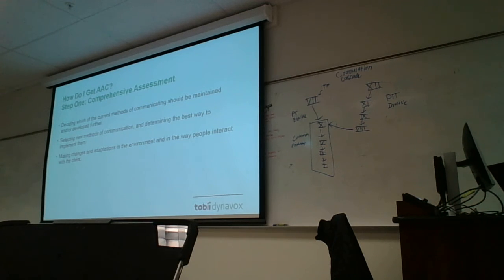There's a vertical tube that comes out, and then there's an arm that holds the device. That could be for users who need to be in bed to use the device, or if they're in a recliner or on their couch, it allows them a little more flexibility. And the third option is a wheelchair mount, something that gets attached to the wheelchair.